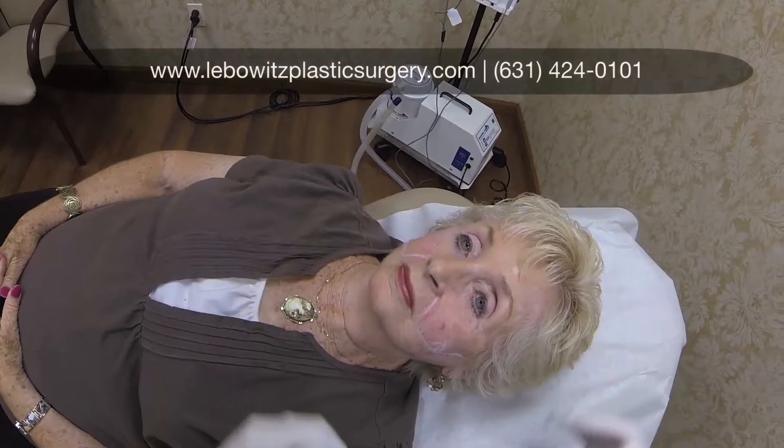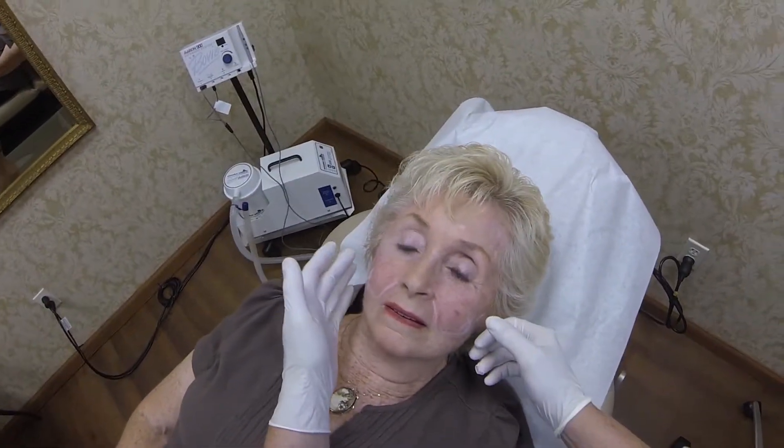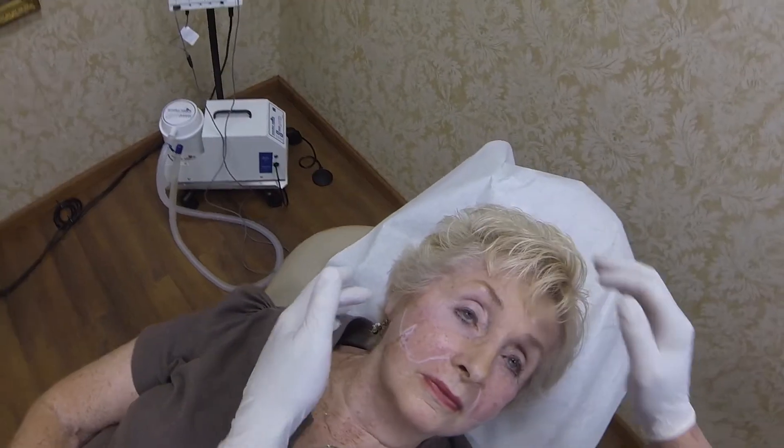This is Dr. Jonathan Liebowitz, Lebowitz Plastic Surgery in Huntington, Long Island, New York. We're doing fillers on this lovely lady to reflate her lost volume of her mid face. We're going to concentrate today on just her cheeks, where we want to reflate and lift and add volume to her cheeks on her left side and then again on her right side.